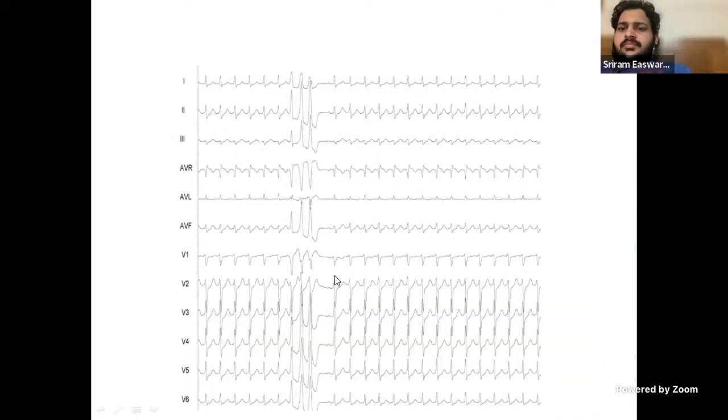So as we were discussing, sometimes you have a tachycardia on the left panel, a tachycardia on the right panel, narrow QRS tachycardia, and something is being done. So what has been done?